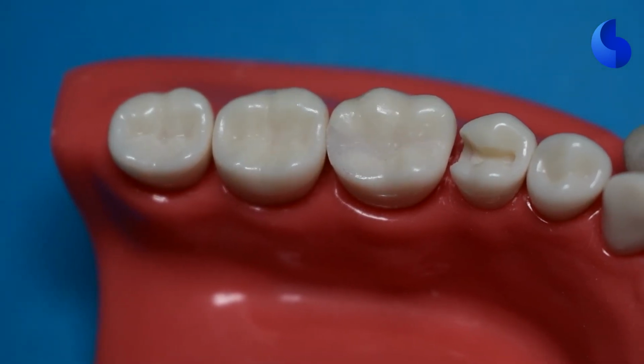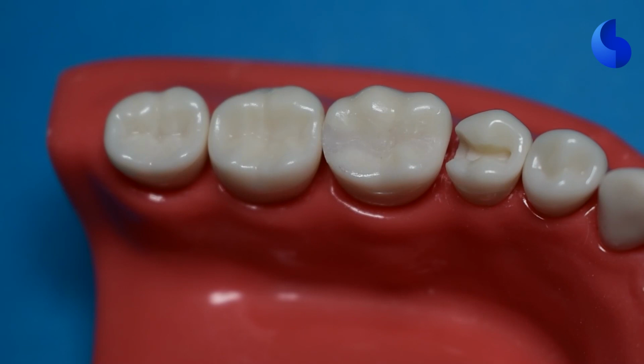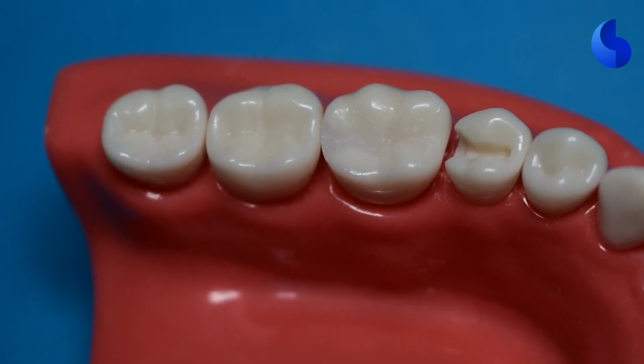And once you're done with that, use a floss to make sure that you have established contact, and then your restoration is good to go.